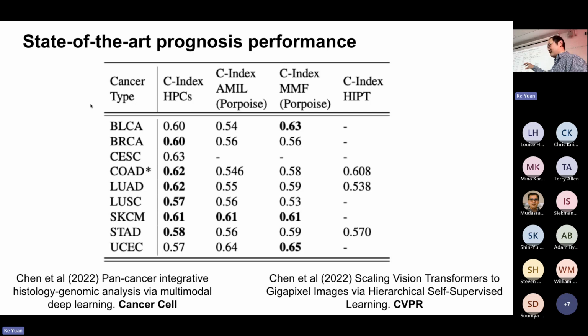It's able to find anything in these 1,000 tiles or tens of thousands of tiles, anything that is remotely associated with the survival label. So you would expect it to perform really well, but actually, as you can see, compared to deep learning based multiple instance learning, a simple clustering and frequency based predictor is quite competitive.